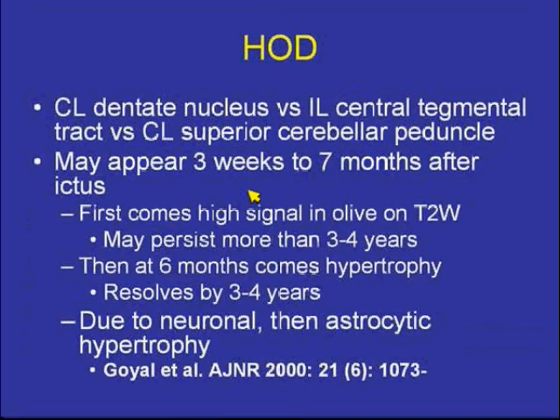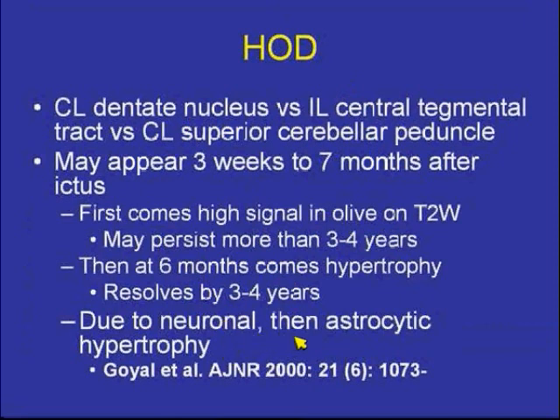The first thing you see is high signal intensity in the medullary olive on T2-weighted scan. Then, after about six months, you see hypertrophy of the medullary olive. This is due to neuronal hypertrophy and then later astrocytic hypertrophy.